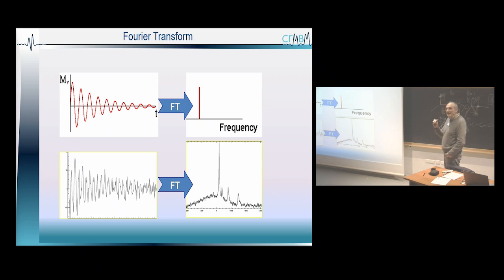Okay, so I've got the identity of the phosphorus nuclei which were in the sample when I was doing the scanning. And they have different frequencies in here because, as I said to you before, the electronic environment is different, okay? And so we know who is who. We know which molecule is this one in here, and which molecule is this one in here. We know everything. Initially we didn't know, but you have to guess and do some phantom scanning, and you can go back to here.